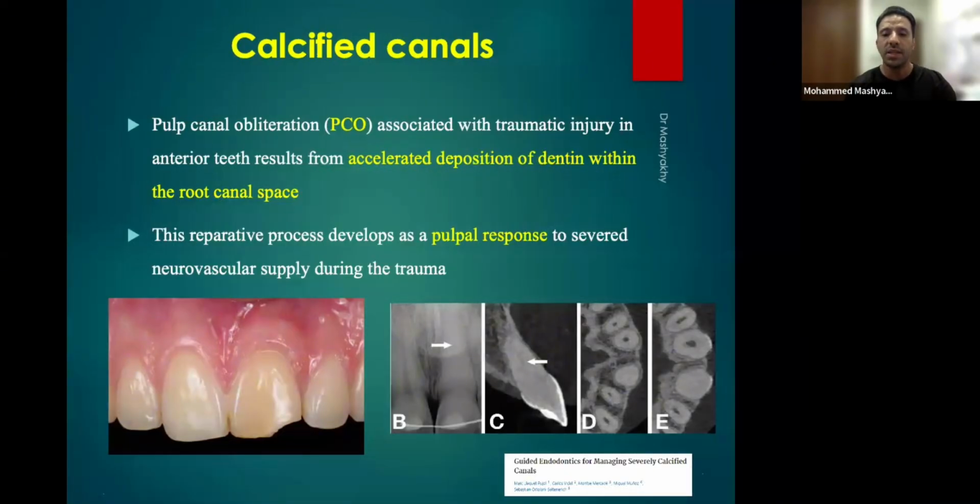You can see that it's very discolored. These teeth don't need to be necrotic. Sometimes they are necrotic, but because of the change of color, when I do the treatment, you can make the tooth much lighter. And sometimes it becomes necrotic, so we have to do the root canal treatment. So this is one of the difficulties that you're going to have.